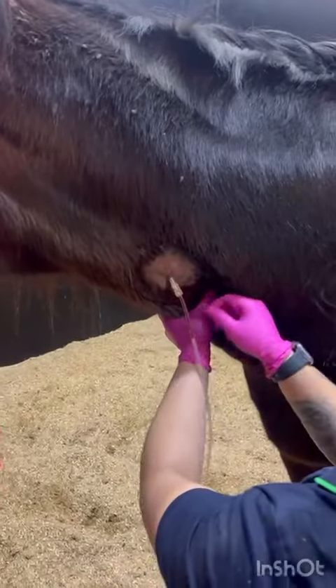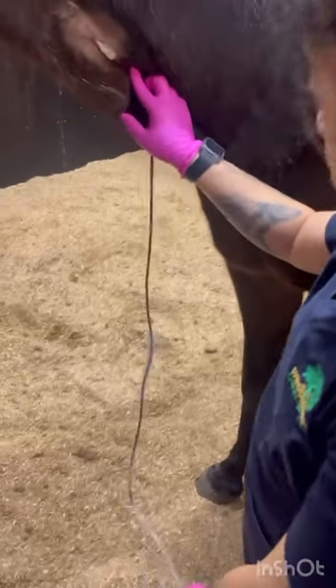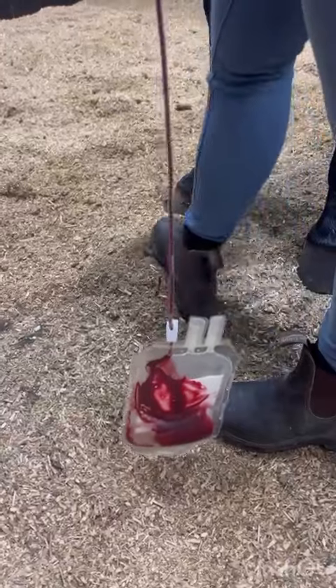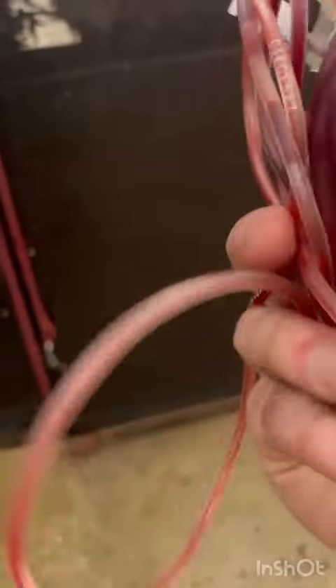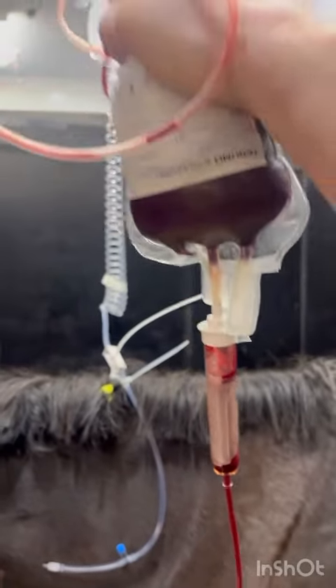So that looks pretty good. Next we get our blood collection bags. They have this liquid which is an anticoagulant — this liquid stops the blood from clotting in the bag. These bags are actually human blood collection bags, so we'll be able to collect about 450 mils of blood in each bag, which is roughly a pint. We will need about 20 of these for our patient, giving us about 9 litres of blood, which is the maximum amount we can collect from our donor.